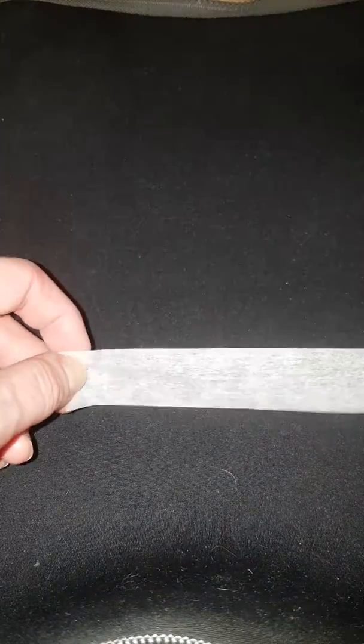Here you're going to have a bit of a disembodied voice talking to you about how to do your splint with tape. Hopefully this is the tape you have, or if you've got elastoplast that's fine too, because that actually is elastic as the name suggests.